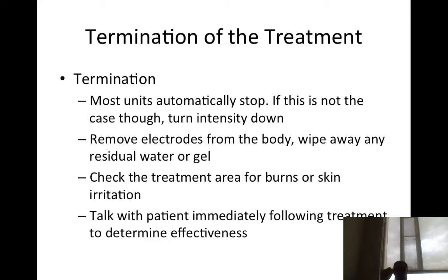It hurts. This is actually a lab that we'll do, hopefully, when we're on campus. You remove the electrodes from the body. Wipe away any residual water or gel, which you shouldn't have any gel, right?